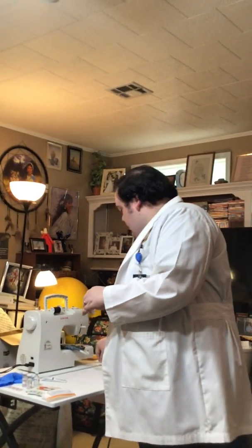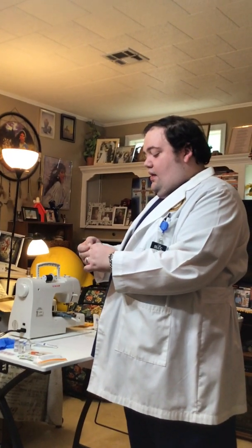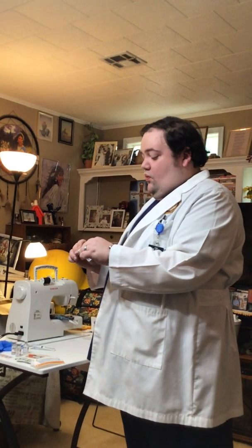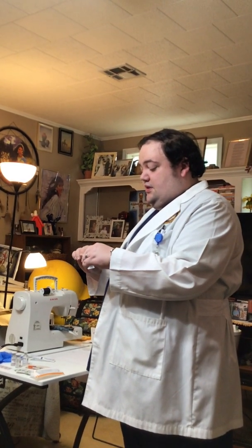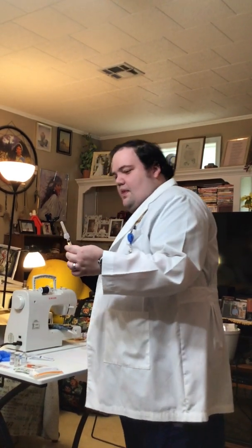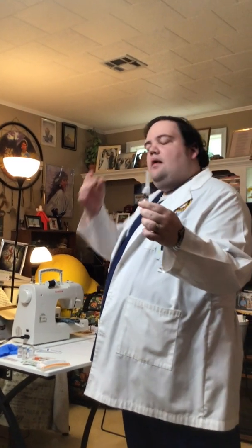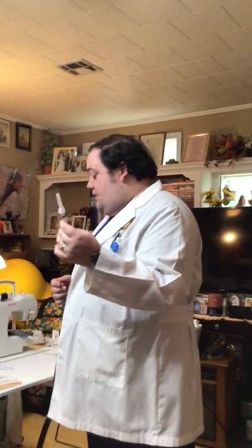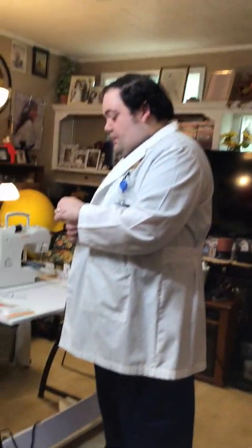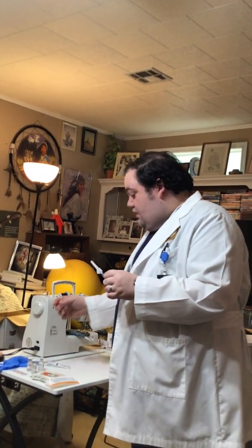And the correct order for this drug is actually 1.5 cc's. Use the same method. This is actually a 1-inch needle. And the reason it's a 1-inch needle, because I'm going into the deltoid muscle. And I don't want to go too deep with the needle, it's too long.